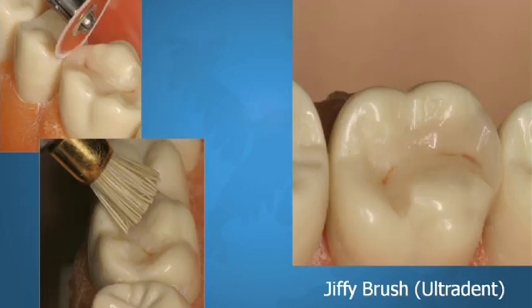The final step is always going to be to make sure that your proximal ridges are rounded. You never want to have your restoration with 90-degree angles on the proximal areas. You always want them rounded, just like nature. Nature is always rounded, and it's mechanically better. You have less chances of breaking, of chipping. And the final polish is using a Jiffy brush.